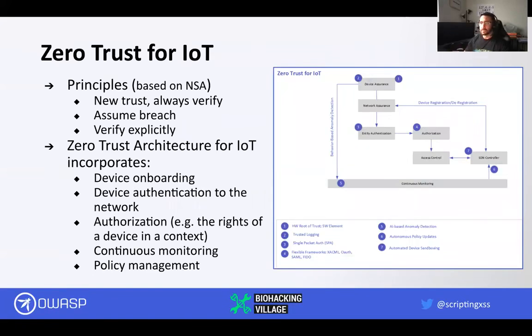So an ongoing project is Zero Trust for IoT. And this is really important for those medical devices that you may be plugging in and, hey, all of a sudden they are paired and they are working. They are onboarded with, again, zero trust or touch, I guess you can say. There's a methodology to the architecture in which we break it down from the onboarding, the authentication, the authorization, and then how you monitor those types of devices and the different policies you want to employ. And then, if there is a root of trust, hardware root of trust, how do you leverage those for that kind of secure identity? Otherwise, if the identity could be tampered with, so could that trust, right?